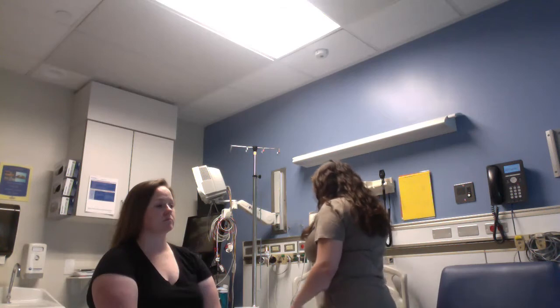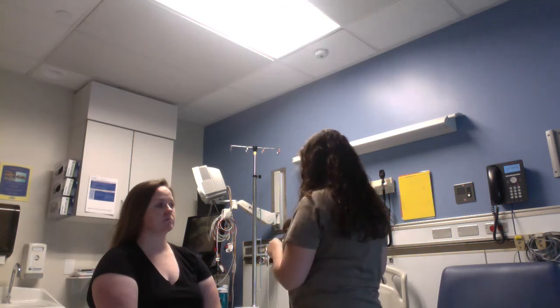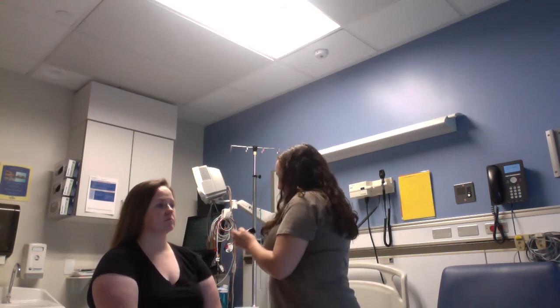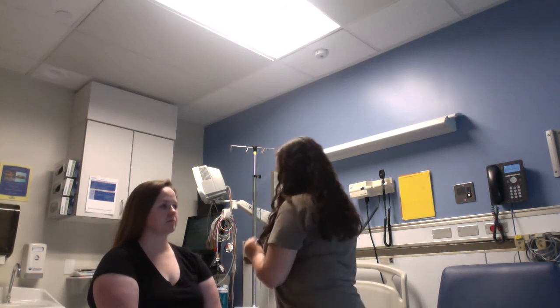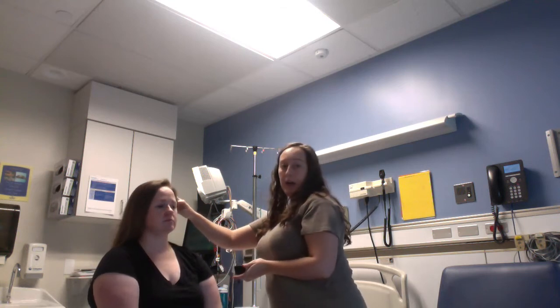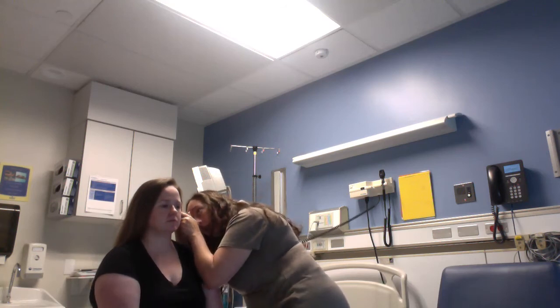So next, Danielle, we're going to take the otoscope and attach the speculum. All right, and with an adult patient, we're wanting to make sure, let's get the speculum on. Okay, there we go. So with the adult patient, we're going to pull the pinna up and back. We're going to gently put this in, and then we're going to look. And what we're looking for is any abnormal drainage.